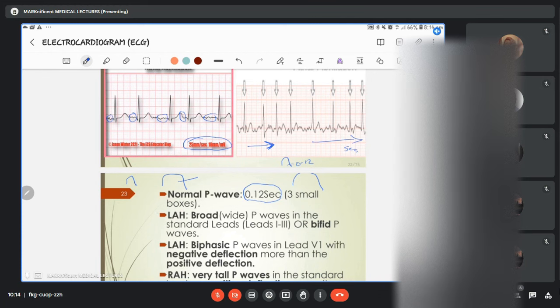If you pick a meter rule or a tape rule, it could be measured in inches or in centimeters or in meters. But if you just go by the estimation that this meter rule is very long, and you don't go with the calibration on it, you might miss the whole concept there. So that's the aid of this calibration to tell you that the calibration is actually in seconds and per box, this is what you have.